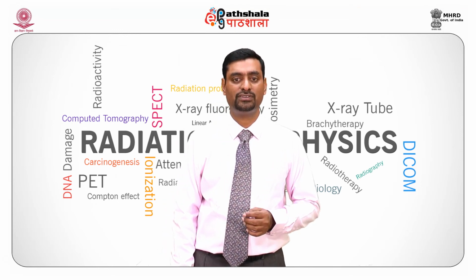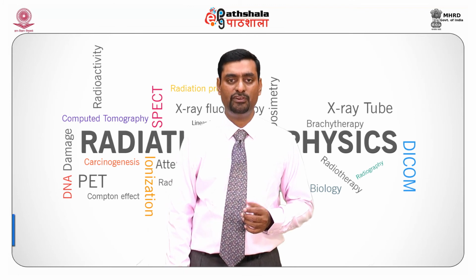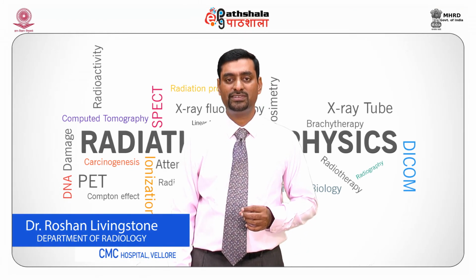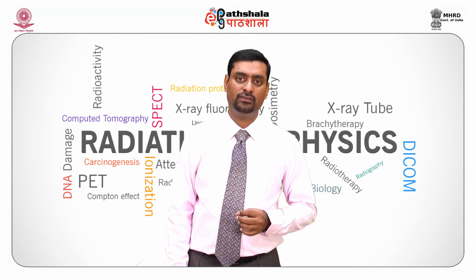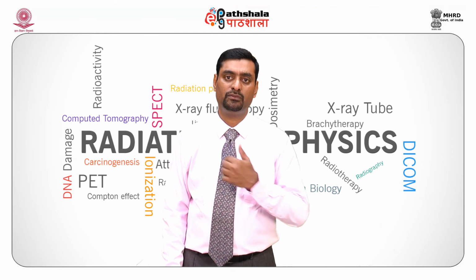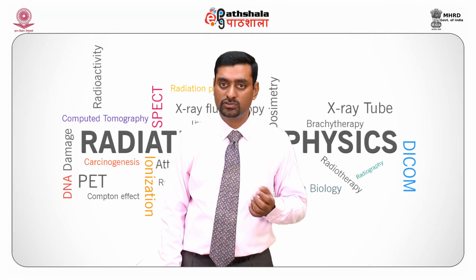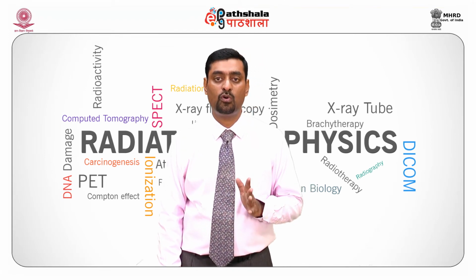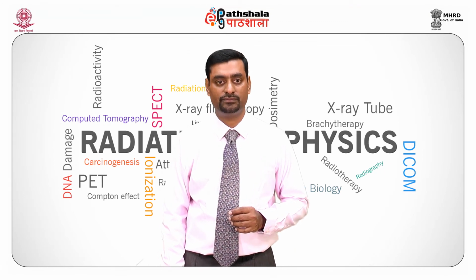Aluminum salts have the tendency to produce insoluble aluminum compounds, which may form sludge that adheres to the film and sides of the fixing tank. Just like how we have the salt in the buckets which we use for our washrooms, if there is more salt, we will see the deposition on the bucket. Hence, to avoid this, boric acid is used as an anti-sludging agent.